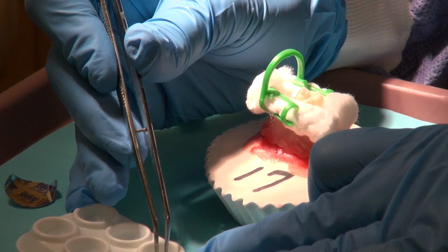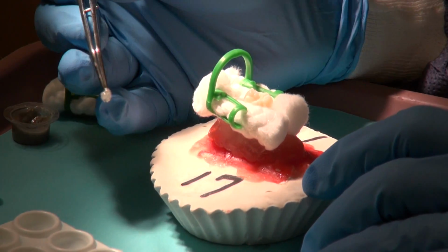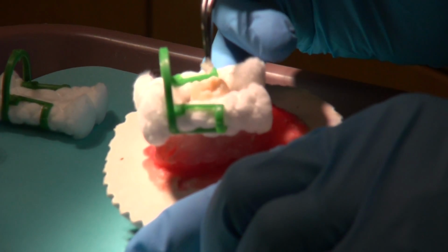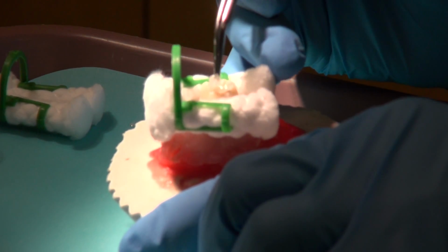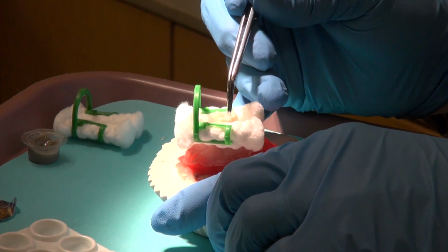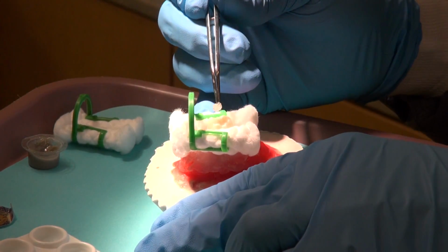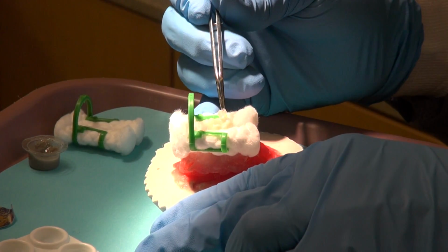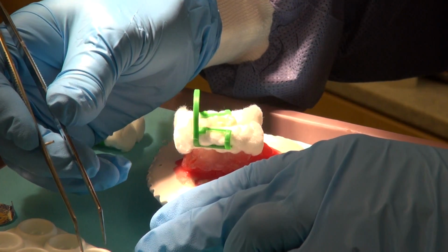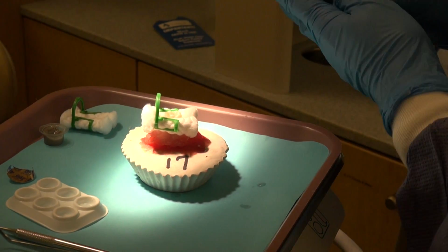Now take your acid etchant sponge into your college pliers, pen grasp, fulcrum, and we're going to dab up and down into the grooves. We are not rubbing. Up and down to saturate the occlusal aspect. We want all that acid etch to run down deep into the grooves and not destroy the enamel rods. If you do go ahead and rub this, you're going to break the enamel rods.